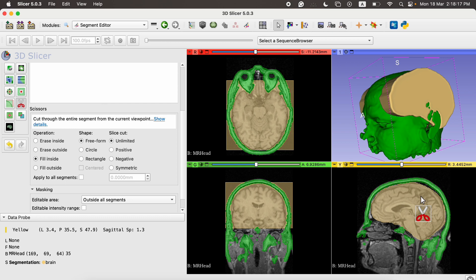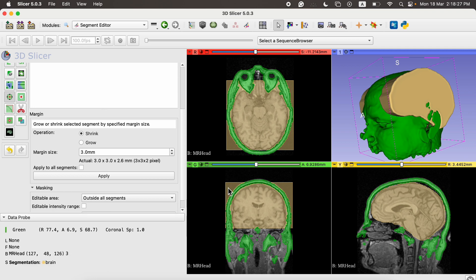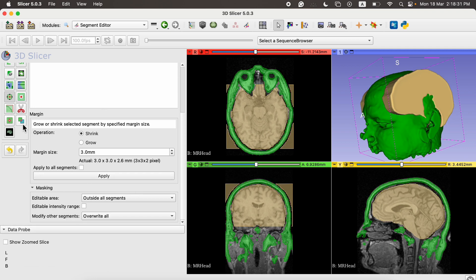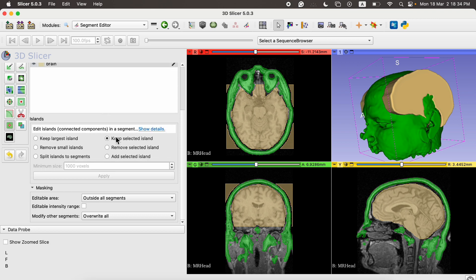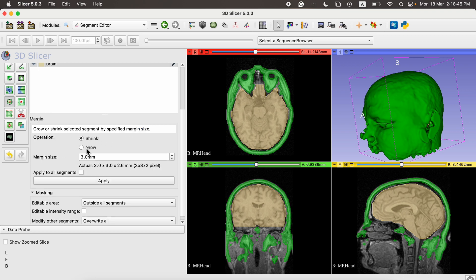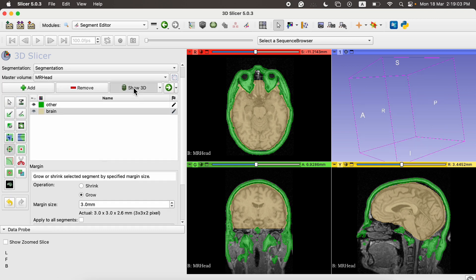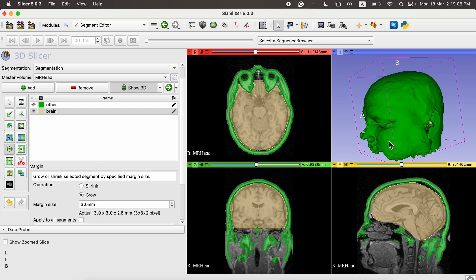After that, click the Margin button and click Shrink to separate the brain from the artifact region and click Apply. Then select the Island button and keep the selected region. Go to the Margin option again, select Grow, and apply — this provides us with the entire brain region without unwanted artifacts. The yellowish region shows the brain and the other color shows artifacts. Click Show 3D to visualize it.